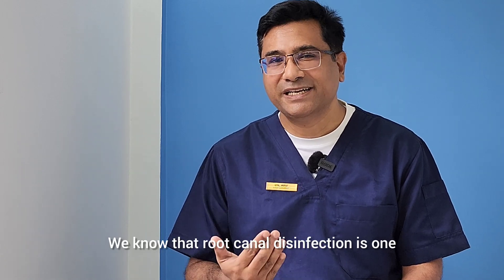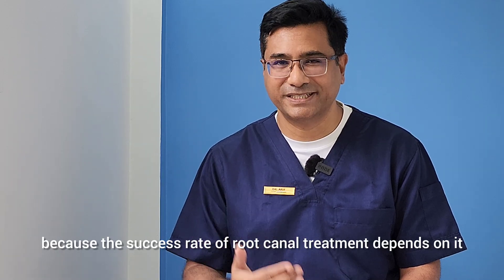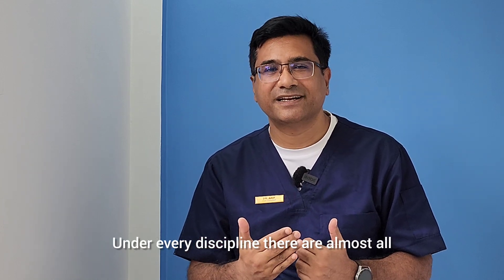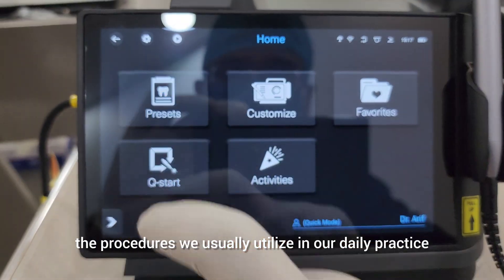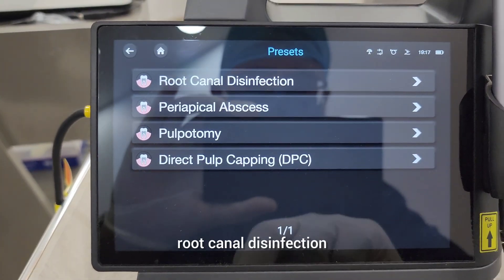Root canal disinfection is one of the crucial parts of endodontic treatment because the success rate of root canal treatment depends on it. The Pion dental laser comes with different settings, categorized into different disciplines, and under every discipline there are almost all the procedures we usually utilize in daily practice, like root canal disinfection in the endodontic section.